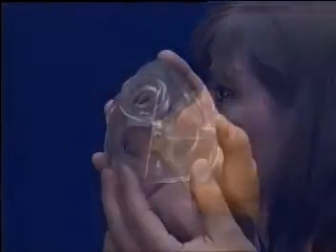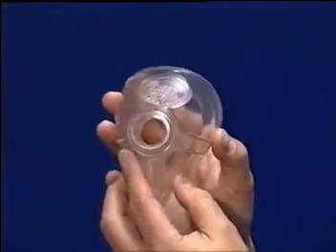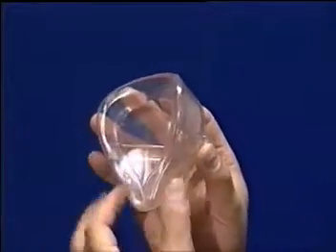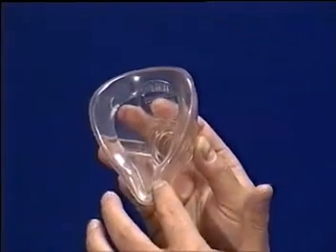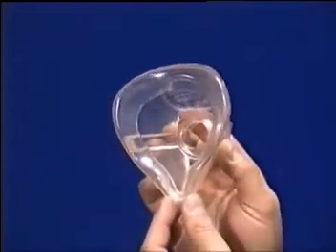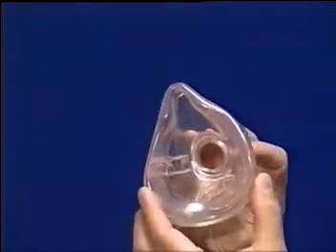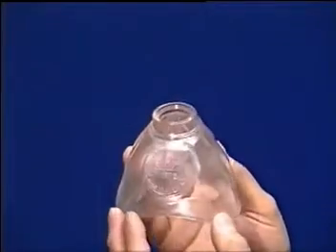For use on infants, the mask is rotated 180 degrees so the wide concave portion of the mask will fit the natural contours of the forehead. The sides of the mask will seal around the natural contours of the cheeks with the narrow end of the mask resting on the point of the chin. This universal design eliminates the need to carry multiple size masks and prevents delays in starting resuscitation efforts.